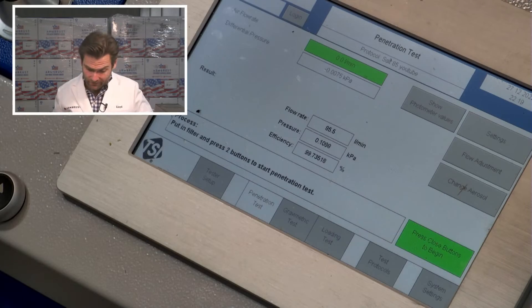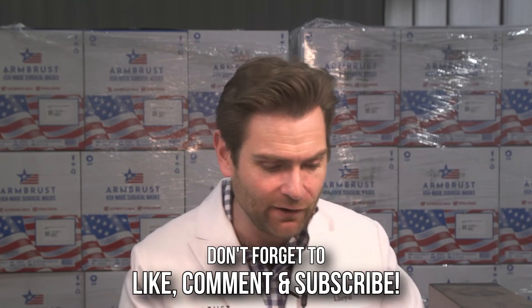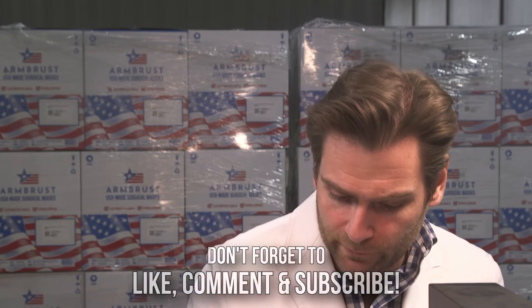But what does the machine say? 109 pascals, 109.8 — 99.735, 99.735. Benny Hall N95, says N95. It's probably going to be a good product.